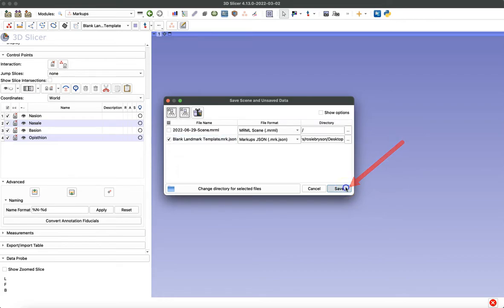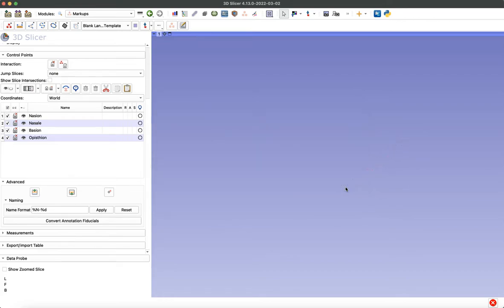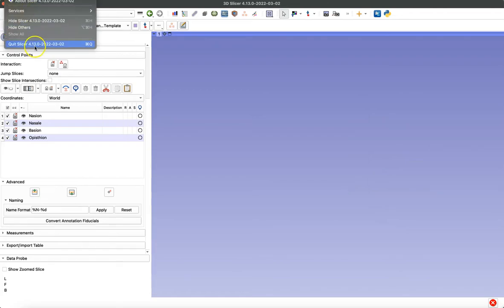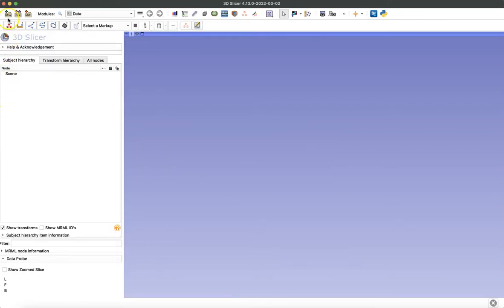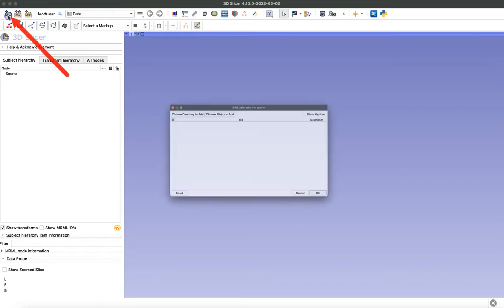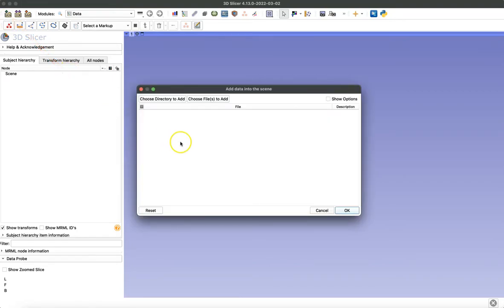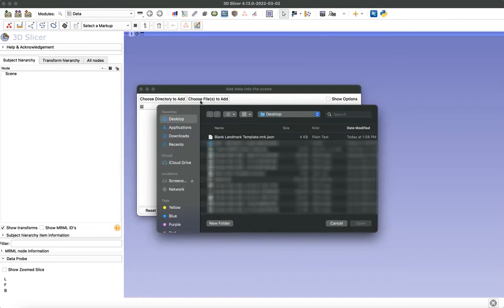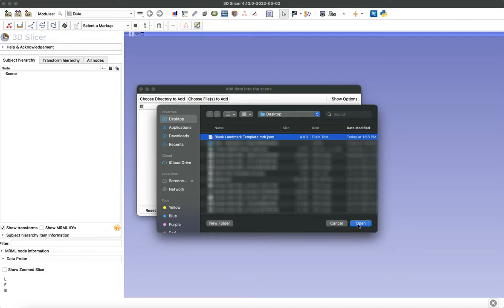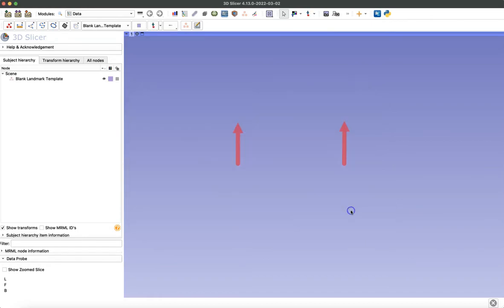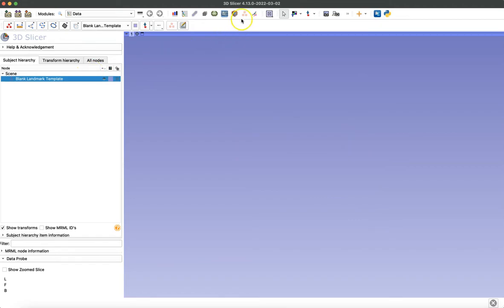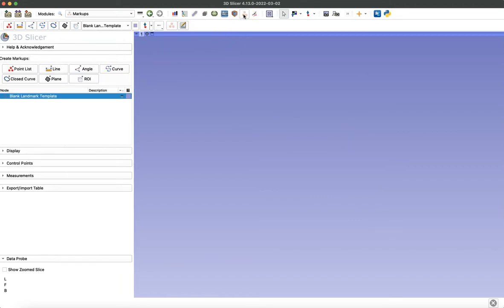Now I'm going to close out Slicer, as if we were starting a data collection process, and I'm going to pull in that blank template we just created so I can practice taking points. I'll do that by clicking this data icon to the left. Now I'm going to choose files to add and then select that template we just created and click open. This window is showing us it's a markups file and it's in the right format. Now we have to navigate back to that markups module by clicking the icon at the top or using the drop-down menu.